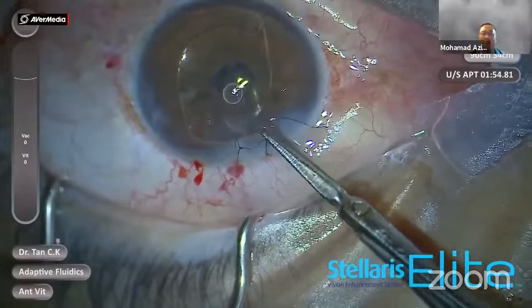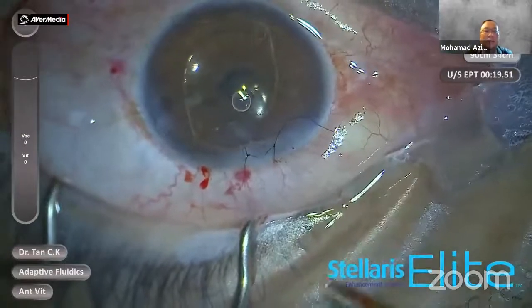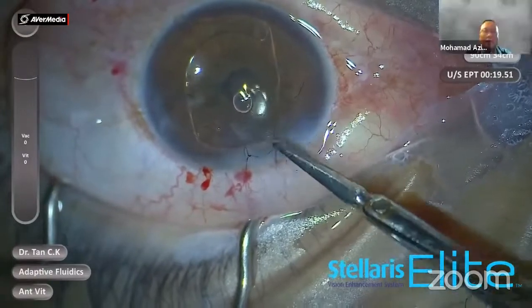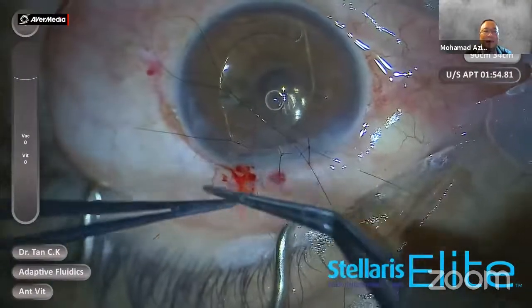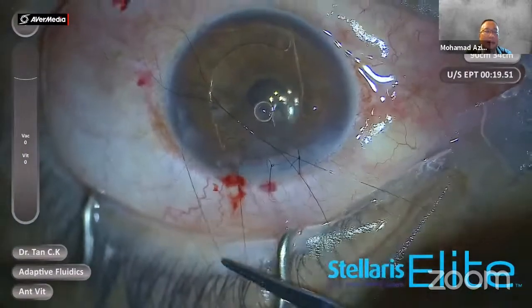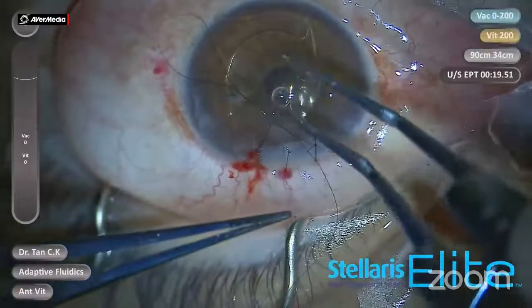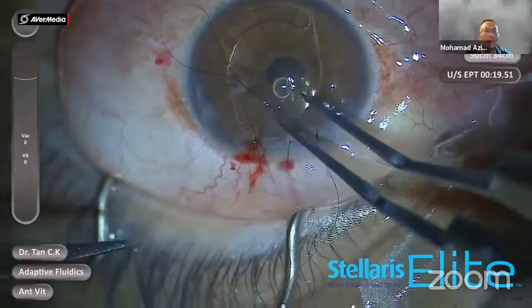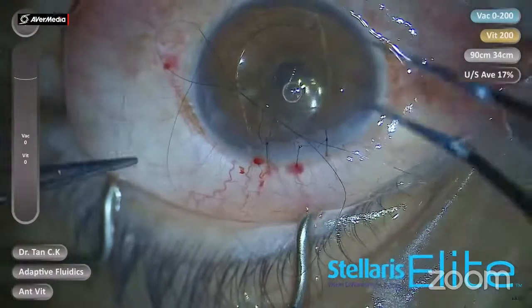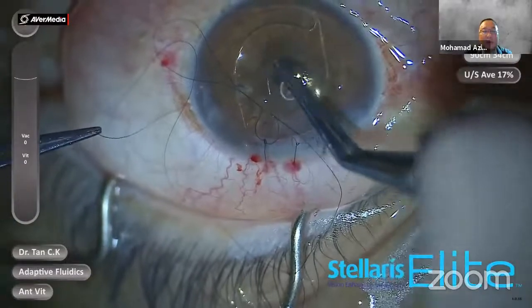The reason why we put up this case is because I noticed when you all do it with Stellaris, when you do high setting chop, you shouldn't see flutter, iris fluttering, meaning the setting is alright. I've called BNL Orbit Medical to come, Ijat to come over and have a look again. I'm worried the adaptive fluidic is not pushing fluid. The bottle height is only 50 and I doubt I had 50 during my setting. There's a delay, and after that I noticed 50 cm only, and it is adaptive fluid. I'm worried the adaptive fluid is not working.